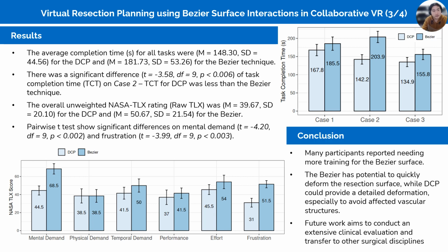So in conclusion, we have presented a new approach for defining resection surfaces for virtual resections, making use of the cubic Bezier surface in the collaborative VR environment. The result of the pilot study shows insight for both interaction techniques. However, the number of participants was relatively small, and the aim of the formative study was to test and collect feedback for improvement, since it was the early stage of system development.